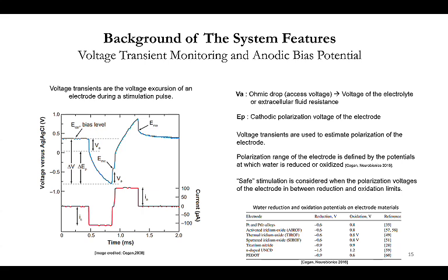Then the curve shape is like a capacitive charging of the electrode, and basically we will see a smooth transition, because the electrode surface is iridium, but it will be oxidized, and there will be another layer on top of the iridium, called iridium oxide. Because of that, there is a capacitive feature, and because of that, we see this curve shape.